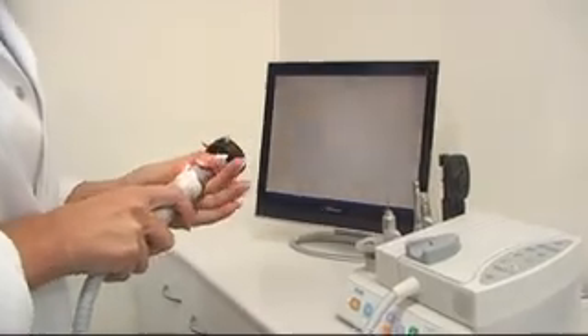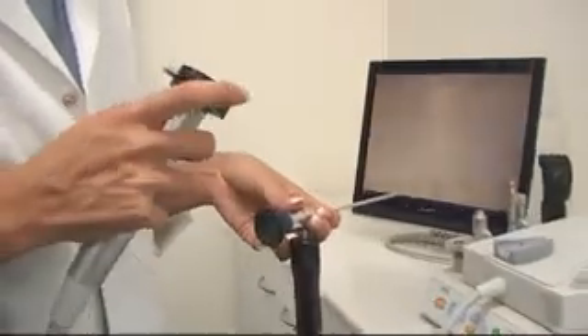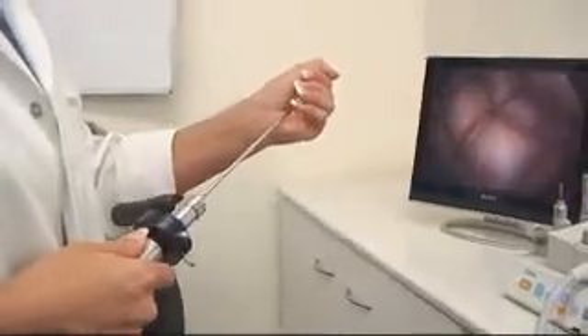The endoscope adapter probe allows the camera to be used with most commercially available brand name medical entities. An external light source will be required for the endoscope, as there is no connection to the Microvision light source.